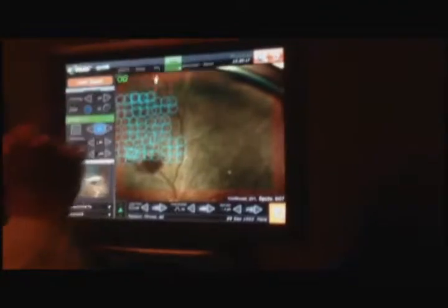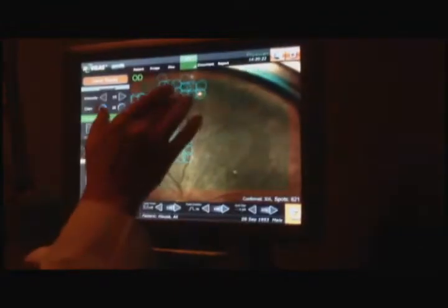As you can see, we are placing these arrays of laser applications with a duration of 100 milliseconds, and the patient's ocular movements are compensated by the navigation function. We can also capture images during the photocoagulation procedure. As you can see, we have a wide-angle view as we perform panretinal photocoagulation using infrared light, which is not bothersome for the patient.